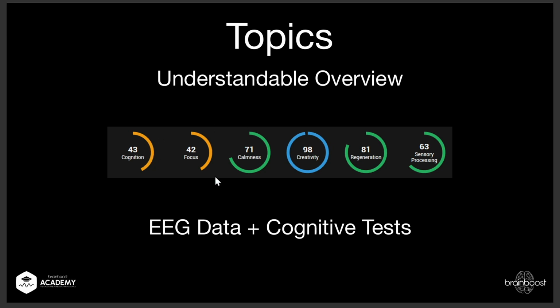These categories also cover not just a one-sided point of view. Some people say, I'm specialized in ADD, so I just want to check the EEG based on that, so just focus. No, you get a broad overview of the entire brain, or the entire person.